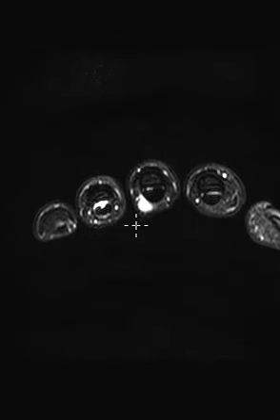And we see that this fluid pocket here, this little bright area, is really sharply defined. It's very uniform and it's very bright. And when you see something that's very uniform and bright, it's usually a small fluid pocket, a cyst. And we can see that this is intimately associated with the flexor tendon or the flexor tendon sheath.